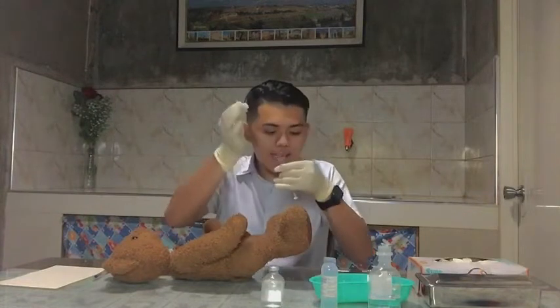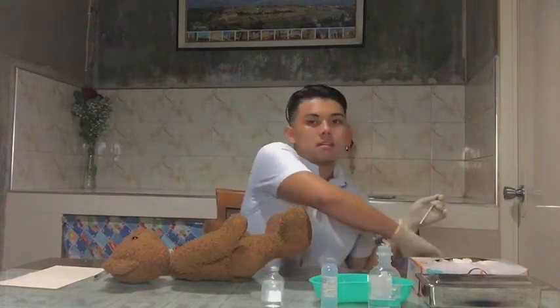Now expel any air bubbles from the syringe, because small bubbles that adhere to the plunger are of no consequence. But a small amount of air will not harm the tissues. Grasp the syringe in your dominant hand close to the hub, holding it between the thumb and forefinger, and hold the needle almost parallel to the skin surface with the bevel of the needle up.